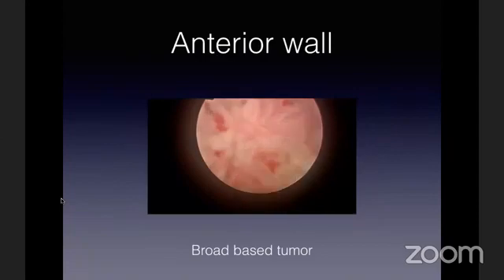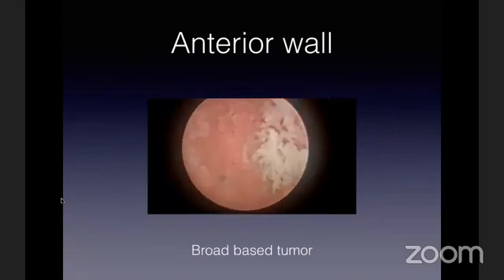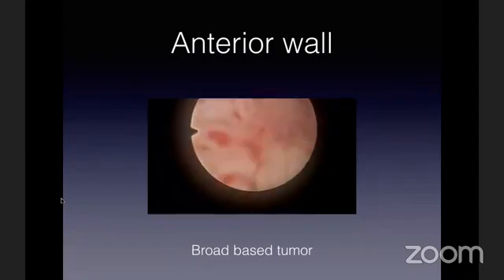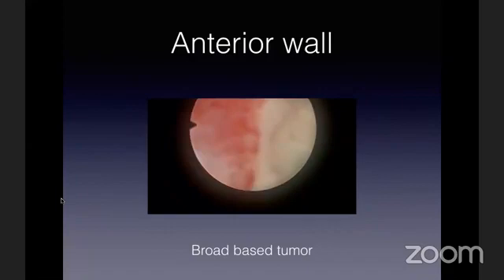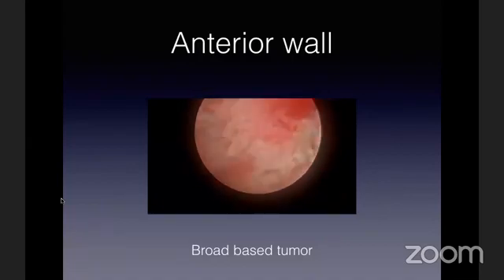This is another patient with a very large broad-based tumor. Even a tumor as huge as this, it is possible to remove it. You need to be patient and slow. Work from different sides, undermine the tumor from different sides, and reduce the stalk as much as you can. Eventually a very narrow stalk remains which can, in the end, be resected and removed.